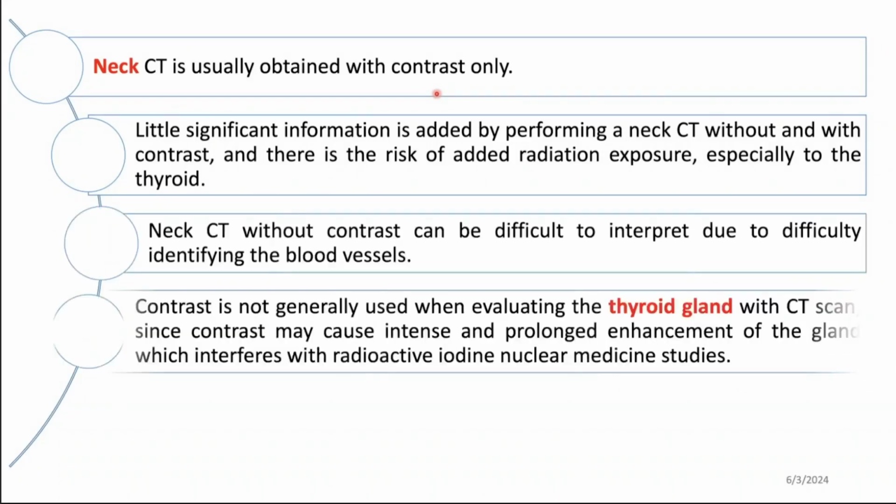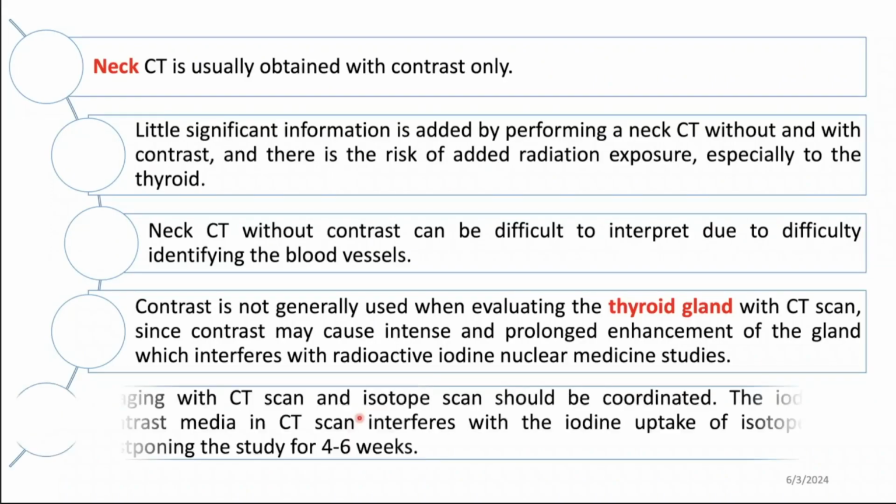All right. The CT of the neck without contrast can be very difficult to read without intravenous contrast, because sometimes you cannot really evaluate lymph nodes from vessels and things like that. Okay. This last bullet point here is very, very important.